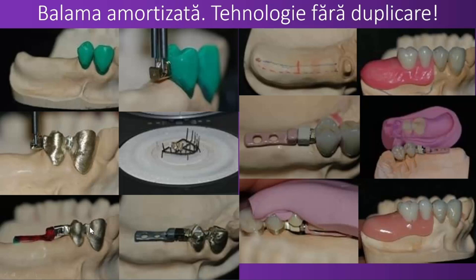Anyhow, so I have the metal components, 2 crowns. They will receive the ceramic, and on the distal of those two, on the distal crown actually, here I have my patrix of my hinge, and then the matrix that has also glued on another part that now is in resin, as you see it, red pattern resin, under wax, special composite that is castable. And after we do that, continuing the mobile part, it will be adhesively glued, resin cement glued, to the mobile part of the denture. So now you see it clearly here.